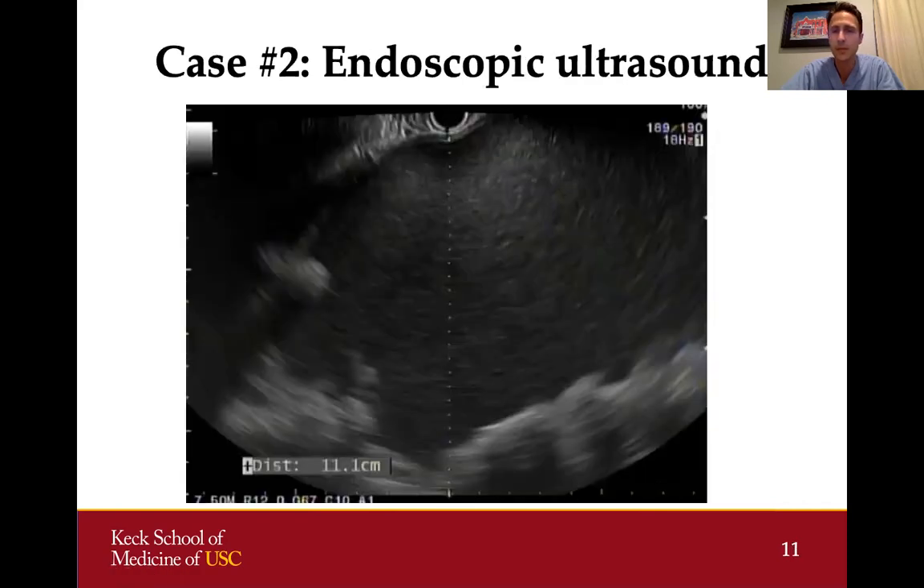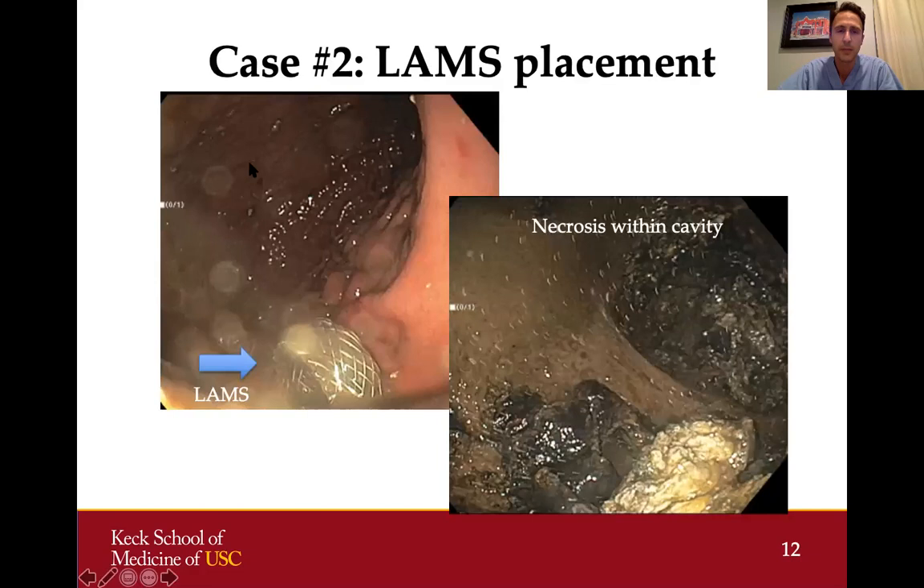On endoscopic ultrasound, we demonstrated the large fluid collection with hyperechoic heterogeneous material layering within it, representing necrotic contents. Not the entire collection was necrotic, but there was a significant amount of necrotic material. We chose to perform a transgastric cystgastrostomy, placing a lumen-opposing metal stent through the wall of the stomach into the collection, allowing it to drain into the stomach.